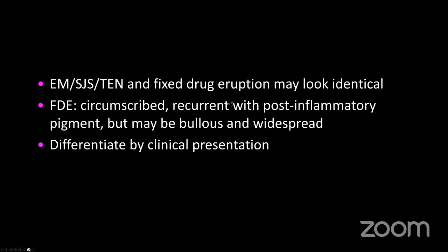So again, these can all look identical, but fixed drug is defined really by its circumscribed nature. However, it can be widespread. So there have been cases of fixed drug eruption that look like Stevens-Johnson syndrome.